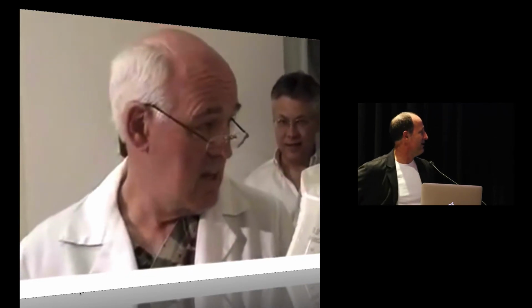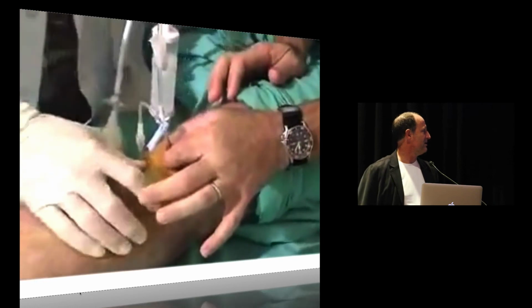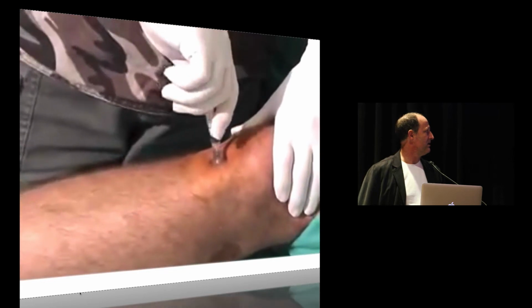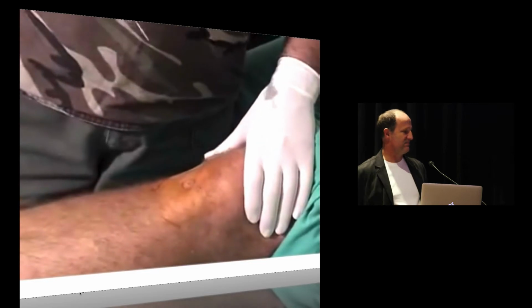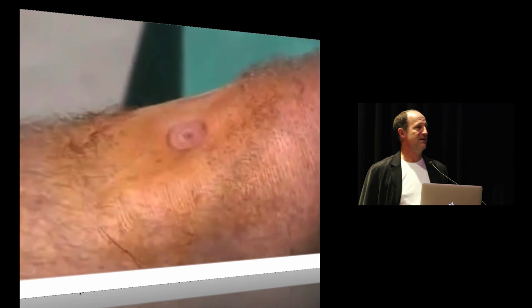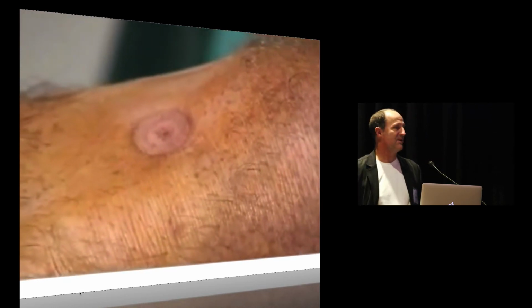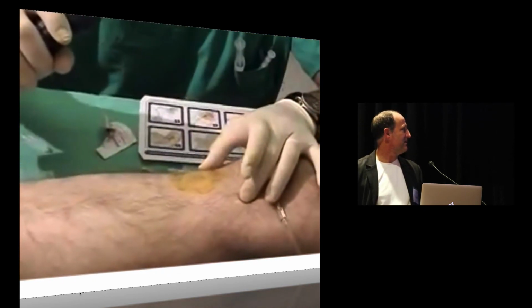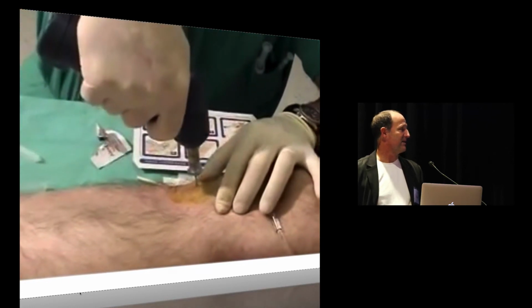It's like, yeah, it's a totally zero. It's totally flat. It's good and stable. I feel absolutely nothing around it. Okay. Okay, we're going to use a technique of holding the leg, pulling gently upward while we twist clockwise. remember, lefty-loosey, righty-tighty. Not a single thing. You see, people are worried about how bad it's going to leak and bleed after you take it out. Not, IVs do worse than that. oh, yeah. 15 gauge IV, can you imagine? It would be pouring out. Ready? I'm ready. Here we go. Okay.